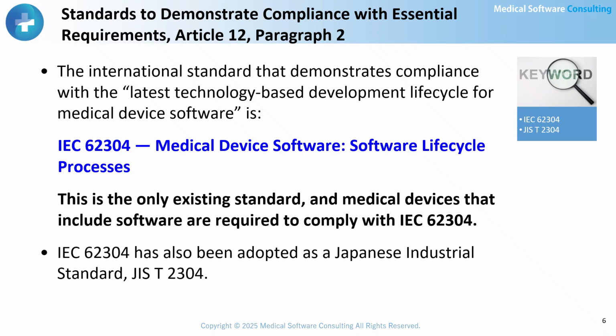To demonstrate compliance with the latest technology-based development lifecycle for medical device software, there is only one international standard available, IEC 62304, Medical Device Software: Software lifecycle processes. Any medical device that includes software is required to conform to IEC 62304. In Japan, this standard has also been adopted as a national standard under JIS T 2304.